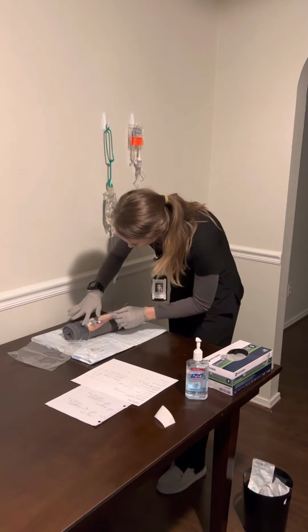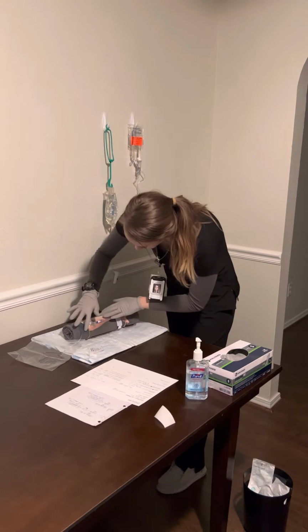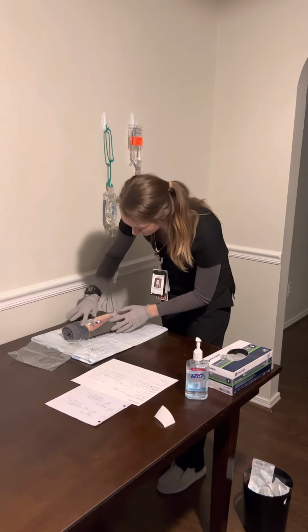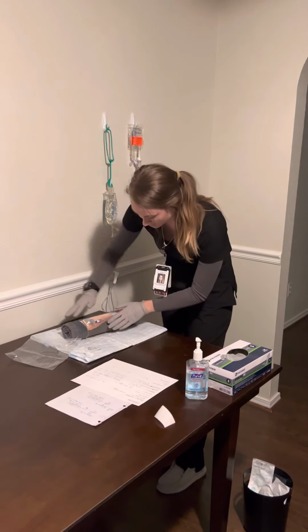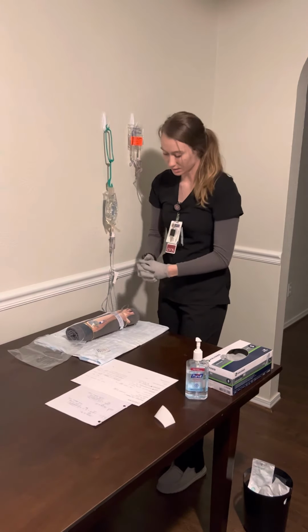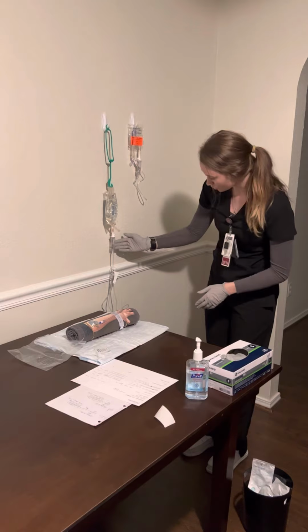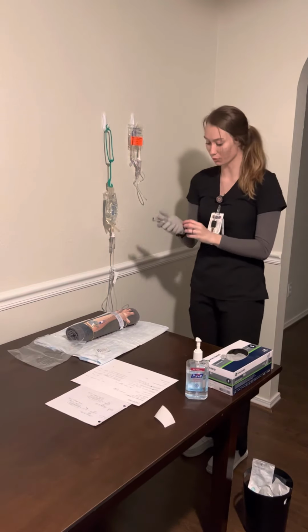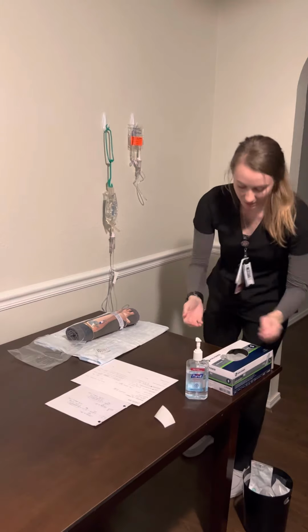Alright, so looking at the site, I don't see any redness or leakage. The area and the dressing is clean, dry, and intact. I don't feel any signs of infiltration or phlebitis, and again, there's no erythema. So our site is still patent and it is dripping. So that looks good. I'm going to remove my gloves and wash my hands again.